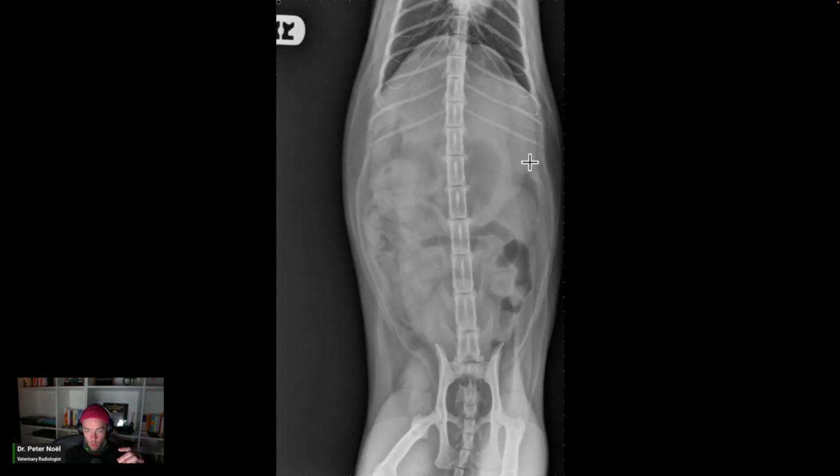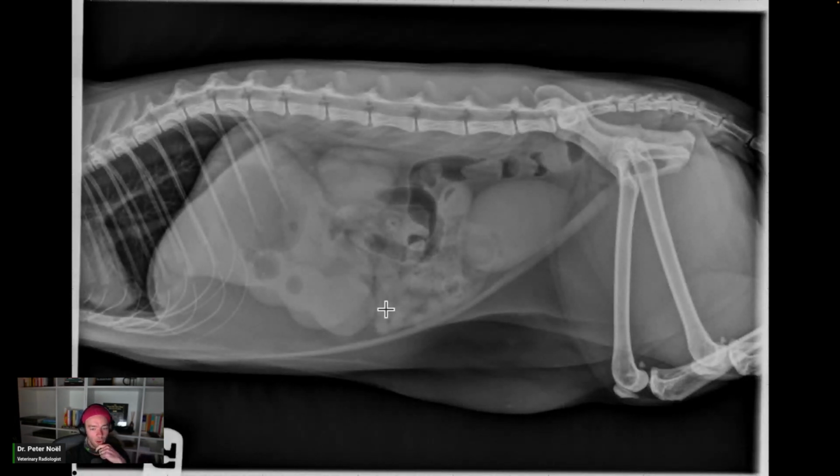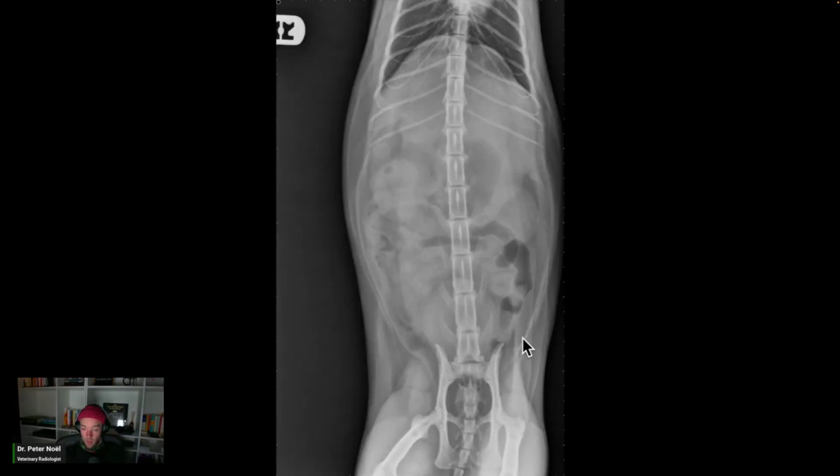Okay. So you will sometimes see splenomegaly. It just fills up this left quadrant, but you'll also see the splenic tail ventrally. Colon, formed feces. So it's acute. This is where we can use that acute thing. So formed feces and gas.